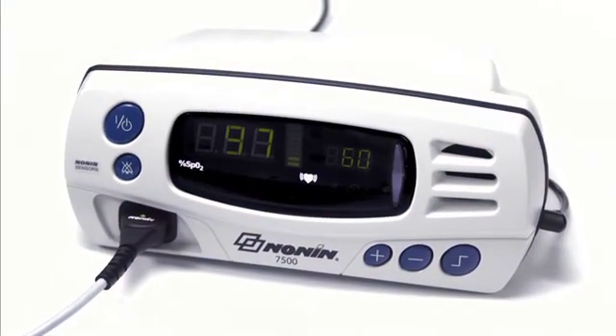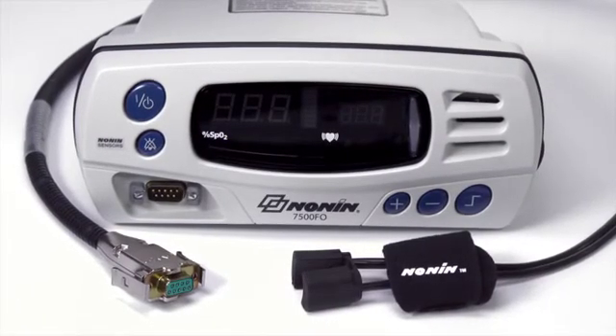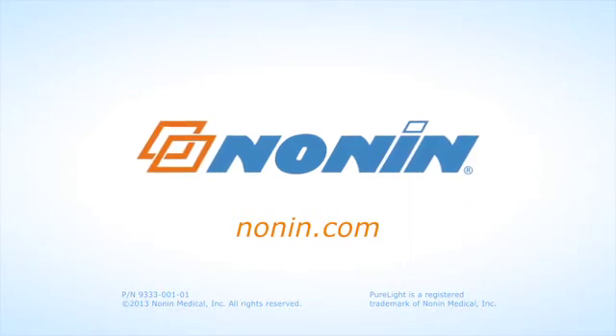With proper use, the Nonin 7500 or 7500 FO pulse oximeter will provide consistent, accurate oxygen saturation and pulse rate measurement. You can find additional use information on this and other Nonin products at www.nonin.com.